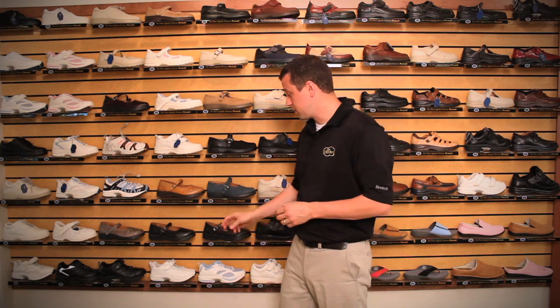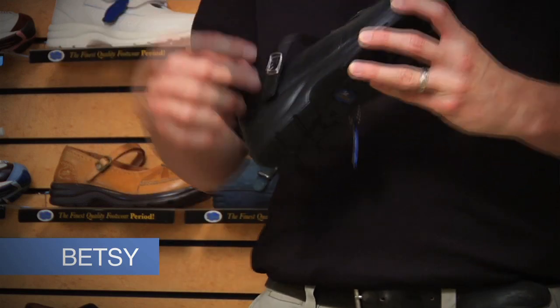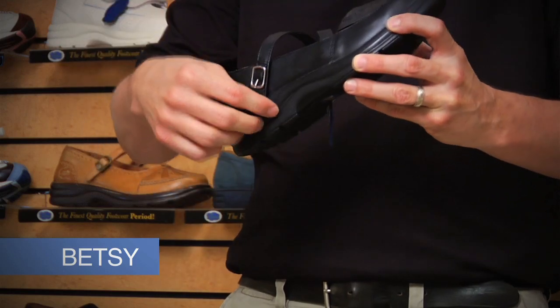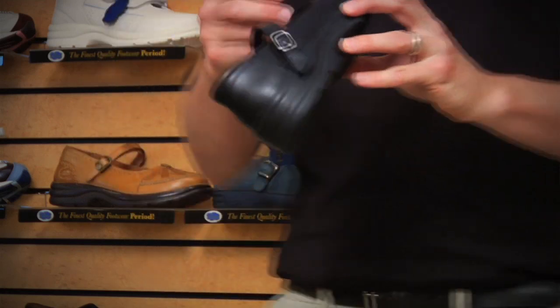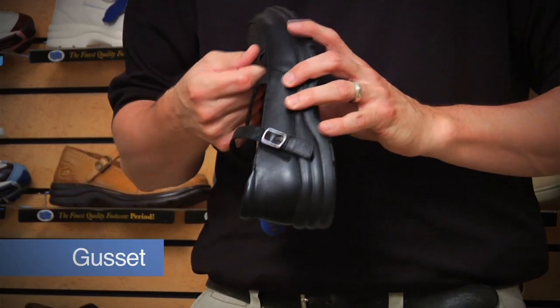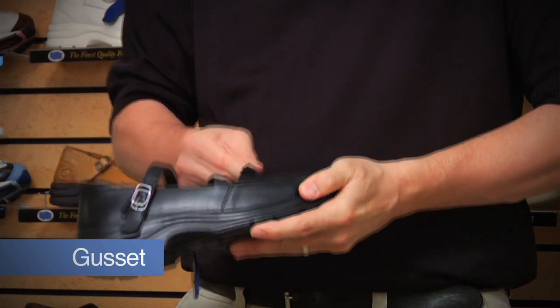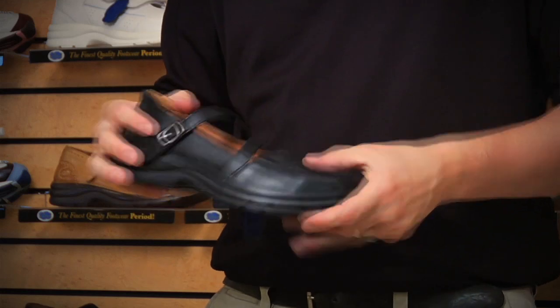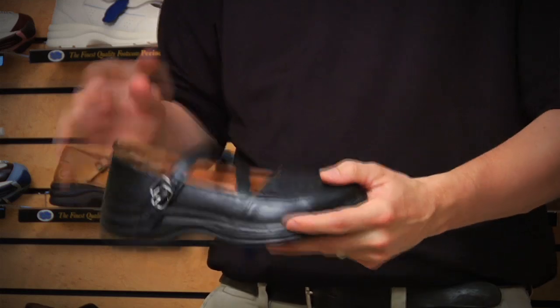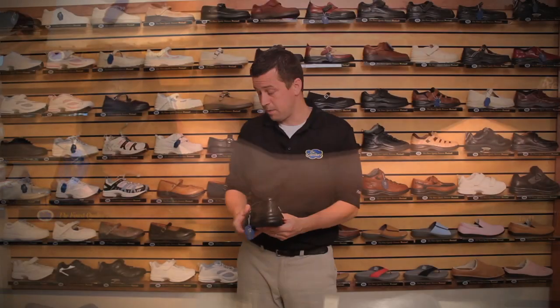Along the lines of Mary Jane, we also have another style called the Betsy. With the Betsy, although it looks like a buckle, it is just a velcro strap — one continuous velcro strap. It also has a special feature called a gusset or goring, which is a stretchable type of material. This is great for significant swelling or just a little bit more forgiveness towards the vamp of the shoe, which is very accommodative for your patient's needs.